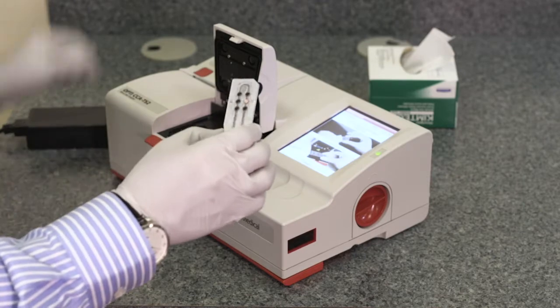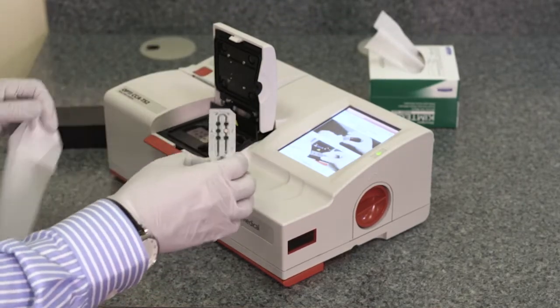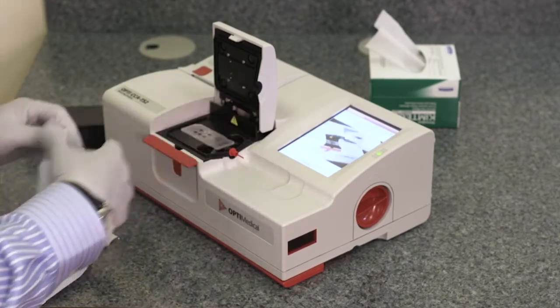Remove the cassette from the pouch. Hold the cassette on the filling ribs and wipe the cassette as instructed. Insert the cassette on the measuring chamber and close the cover.